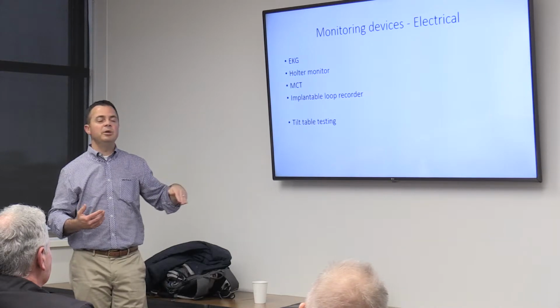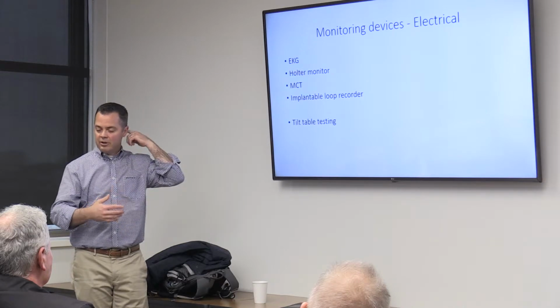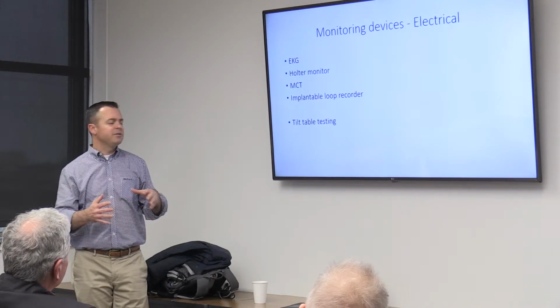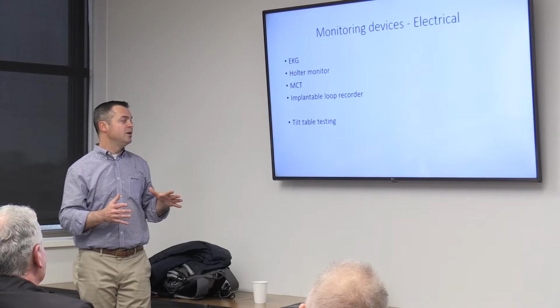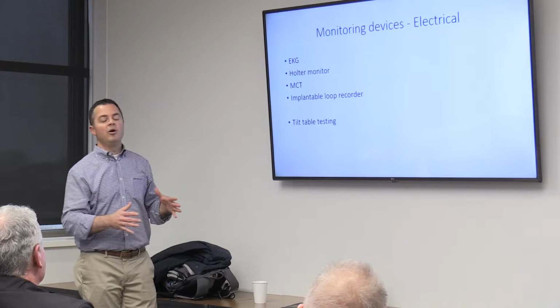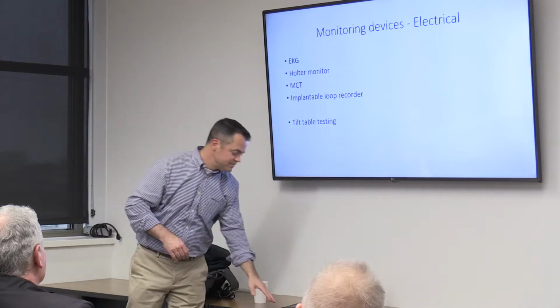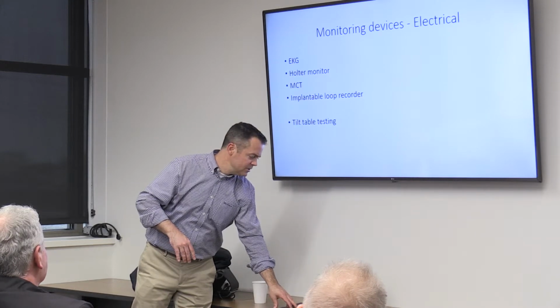We use it for people with passing out or recurrent lightheadedness sometimes. More often it's younger women. I don't know why, but younger women tend to have that type of problem a little bit more. We do have a tilt table here that we will use, so I wanted to mention it. It's not a super common test. Occasionally ordered by neurologists, rarely by primary care doctors, mostly by us. Any questions about the electrical monitors?